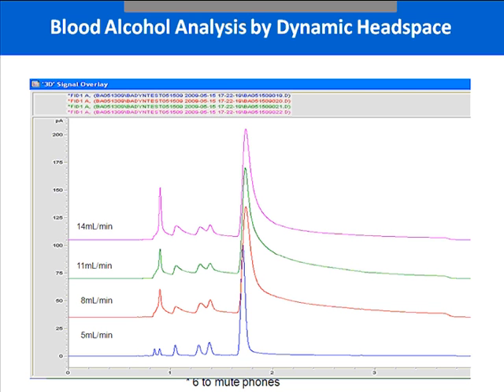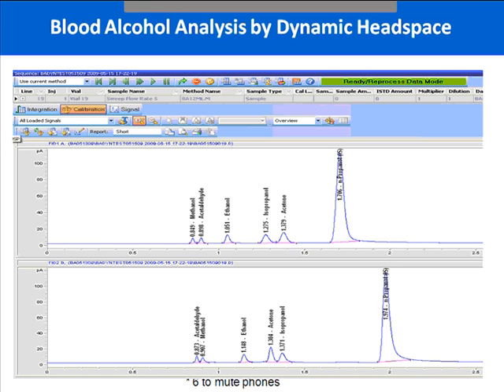The HT3 automated headspace analyzer offers controlling software allowing for multiple parameter changes, as well as alternate vial sizes within a single schedule. The HT3 is a fixed loop system with the option for a trapping module to be added. Both loop and trap analysis can be scheduled in the same run. Static vial pressure is recorded for each loop, and the constant heat feature keeps the HT3 and the GC cycle synchronized. All these unique features enable the HT3 to be a very versatile instrument for any laboratory setting. This shows the optimized method parameters for a 0.002% ethanol standard using both the BAC1 and BAC2 columns.